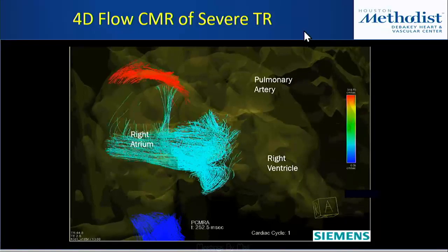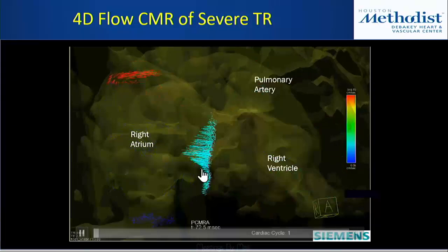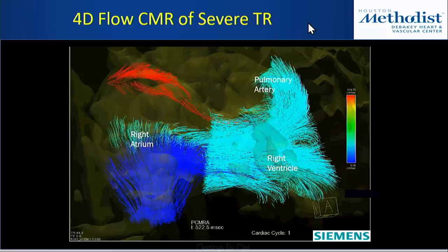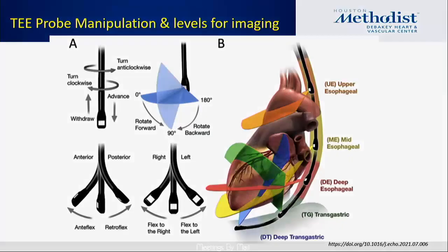And then finally, we don't do a lot of this, but it's always exciting to see 4D flow from CMR. You see the diastolic inflow. You see the regurgitant volume. It's difficult to lay there for 30 minutes and have this protocol done to you, but the images are fantastic, and I've been excited about this for 15 years, and I'm waiting for it to become real time for all of us.